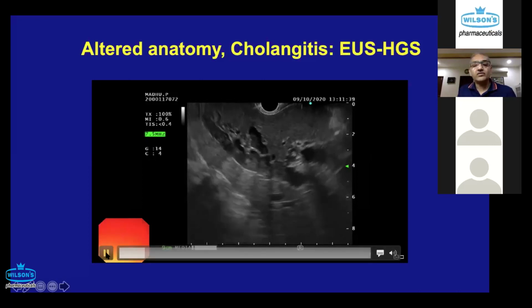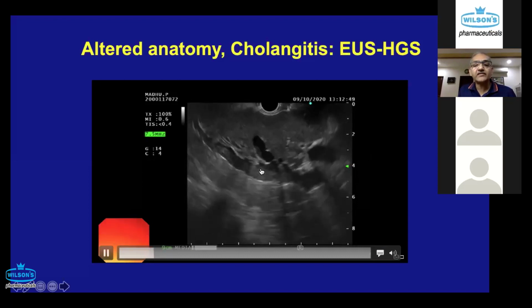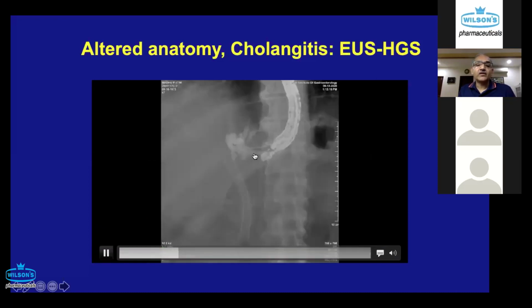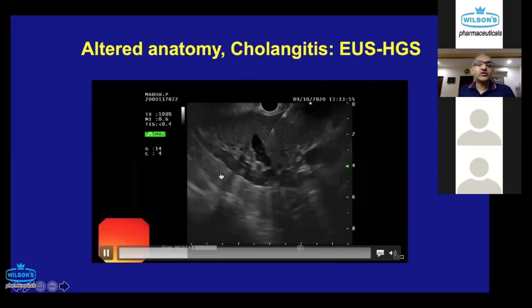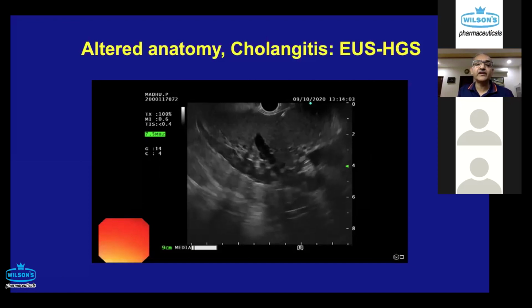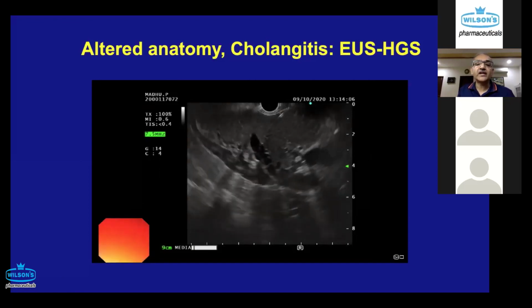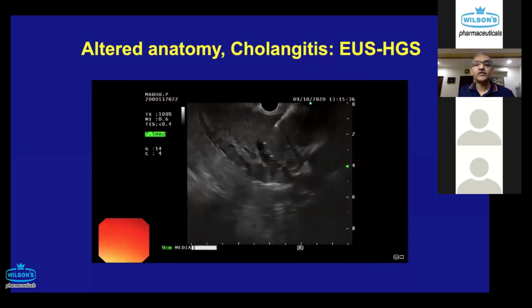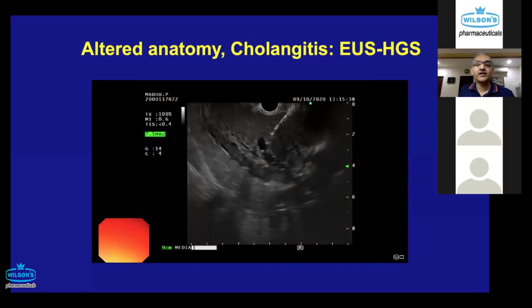So you see this patient has a lot of thick sludge kind of a thing inside the bile duct. Here comes a needle which punctures the small segment. The contrast injection shows that it doesn't go across to the right side. The contrast stays on the left side of the liver, and we leave a guide wire inside. And then over this guide wire, keeping the guide wire always under view of EUS, we pass the 6 French cystotome, which comes now, burns its way in.